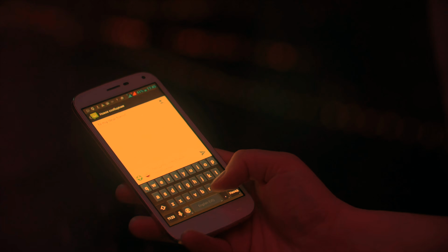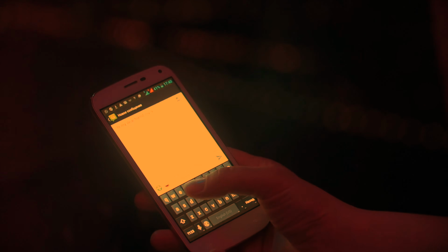It's important as far as the Ishihara plates are observed that we do it correctly. Ideally, we want to be having them observed by daylight, so by a window, or realistically, as in most clinics, a natural light mimic. A light that's too cold or too warm can cause colour deficiencies that aren't true. I mean, we all know what it's like when we've got our phone on night mode, we've got the warm background and everything's got a slightly orange hue. That will be the same as looking at the Ishihara charts with a too warm or too orange base light.